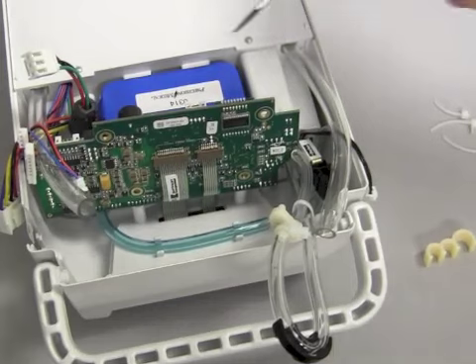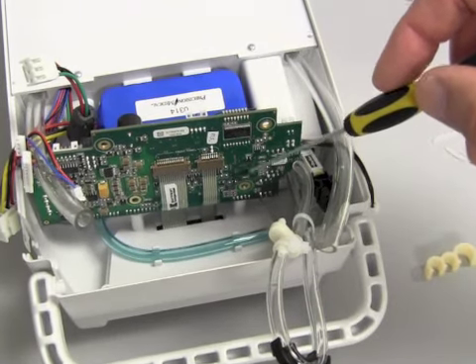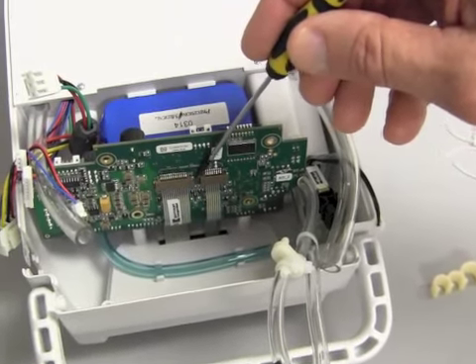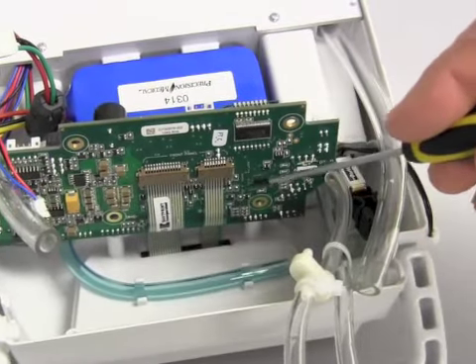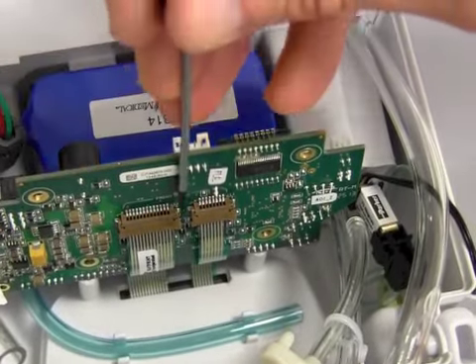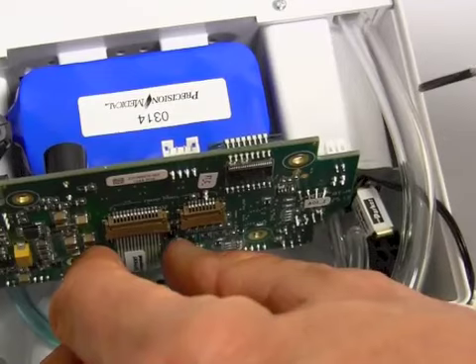The last step to remove the circuit board from the POC is to disconnect the 2 ribbon cables that come from the control knob. This is done by pushing on the tabs on either side of the clips that hold the ribbon cable. When these tabs are depressed, the clips will swing open and the ribbon cables can be pulled away. Now the ribbon cables are ready to be pulled from the clips.